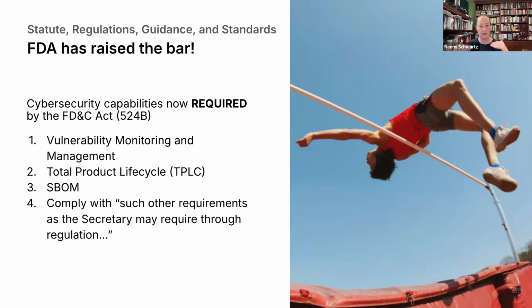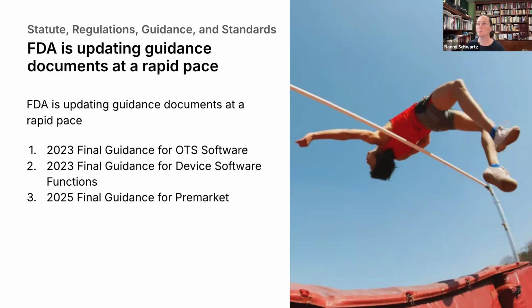Below regulation are guidance. These are recommendations. Now, sometimes FDA staff take the recommendations and the guidance, point back to 524B and say you must have it because 524B says so. If it's actually not written in 524B, that's not necessarily true. So guidance is recommendations, and I hear this from the attorney in my household all the time. Recommendations are not the same as requirements. You should strongly account for recommendations, but it does not mean that you must have every element annotated in the guidance. You must have everything that's stated in the statute. That's really, really important, and a touchy point.